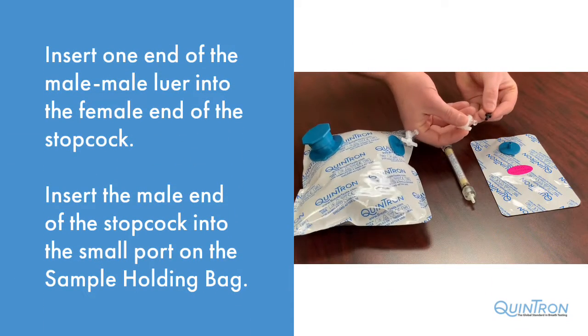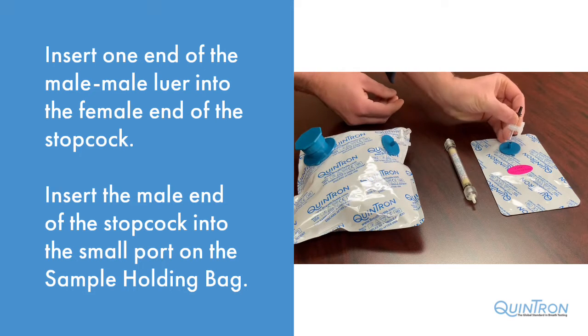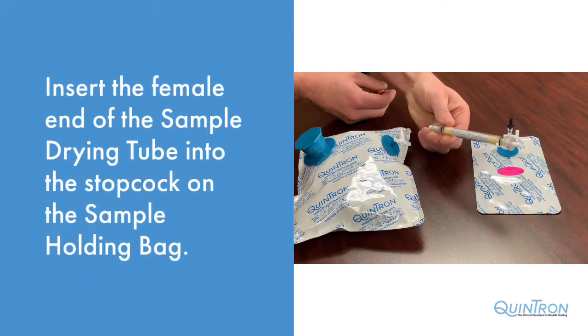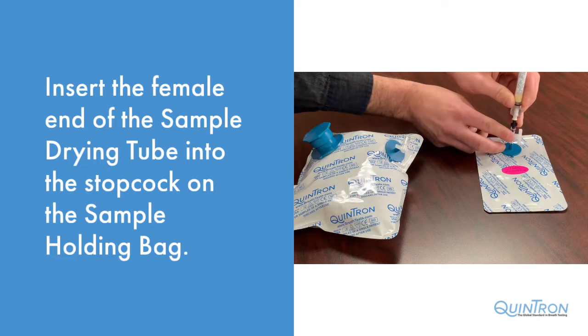Insert one end of the male-to-male lure into the female end of the stopcock. Then, insert the stopcock into the small port on the sample holding bag. Next, insert the female end of the sample drying tube into the male end of the lure.